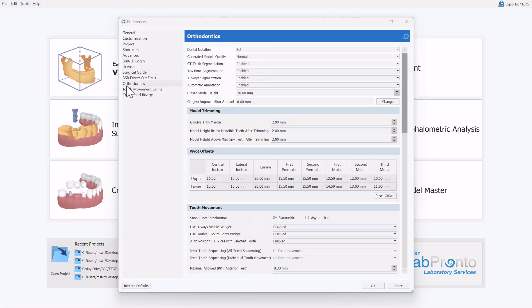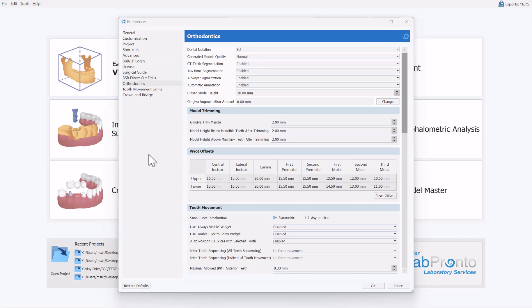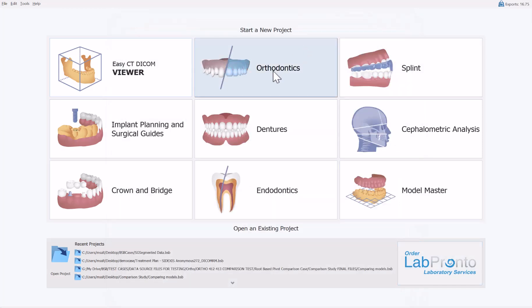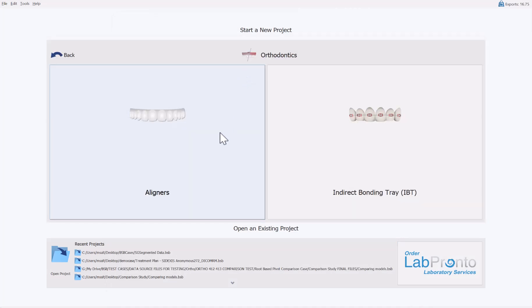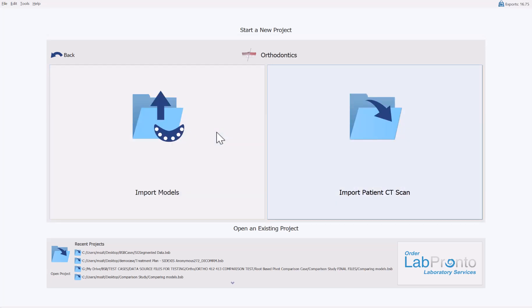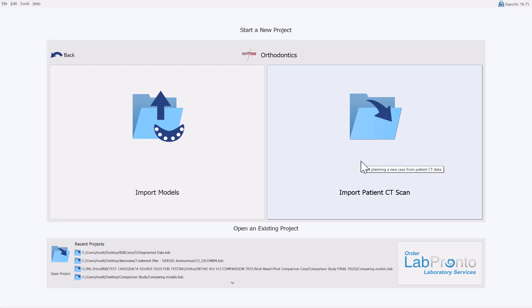Now switching over to Orthodontics preferences: regarding aligner planning, a CT scan is highly recommended so you have full anatomical data with true anatomical movements of teeth, with teeth and widgets placed according to full biomechanical information. The CT tooth segmentation is enabled by default in orthodontics since that is the reason you're loading the CT scan. During the aligner process flow — clicking Aligners, planning the digital tooth setup, then clicking Import Patient CT Scan — the software will merge everything and segment everything automatically.